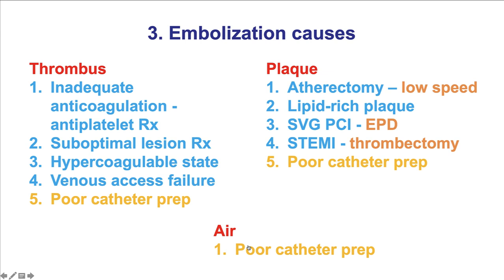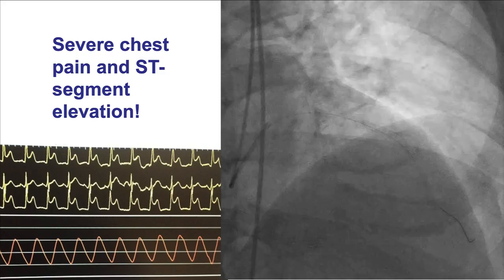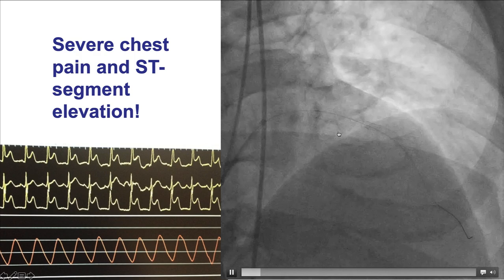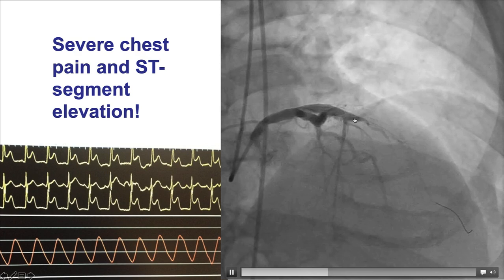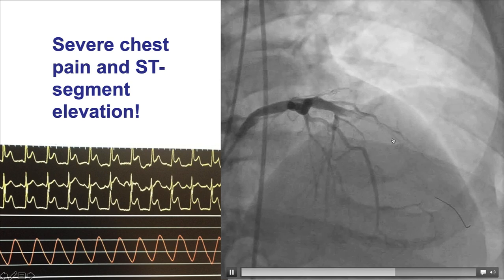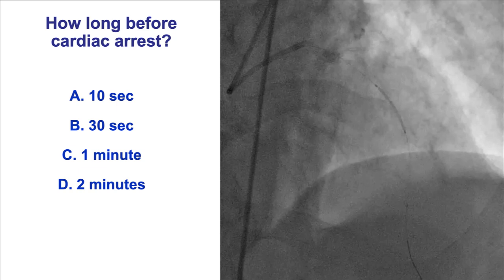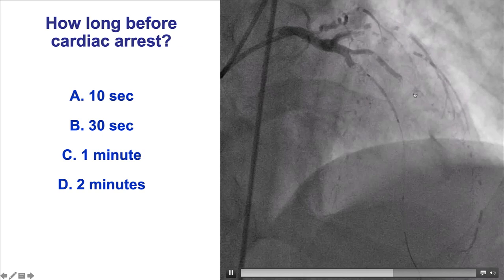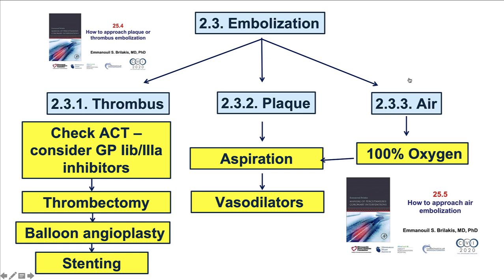Moving on to coronary embolization. Embolization can happen with thrombus, plaque, or air. Thrombus is prevented as discussed in the previous section. Plaque embolization can happen especially in restenotic lesions or in saphenous vein graft or ACS PCI. Air embolization usually happens because of poor catheter and manifold preparation. This is an example of a patient who had PCI of the mid-LAD and suddenly developed chest pain and ST segment elevation, with a typical back-and-forth movement of contrast through the recently placed stent, typical of no-reflow. This is another example of massive air embolism, which led to cardiac arrest in this patient.